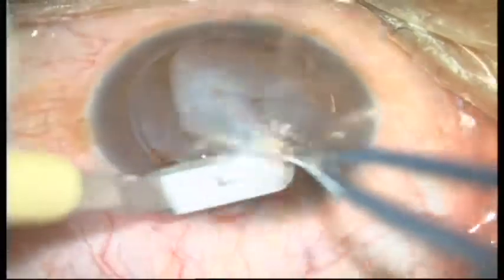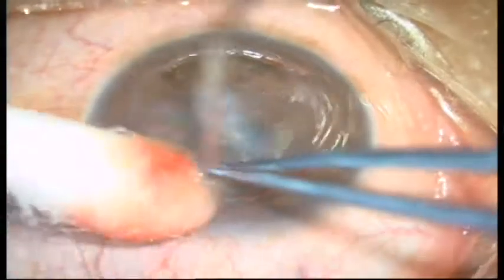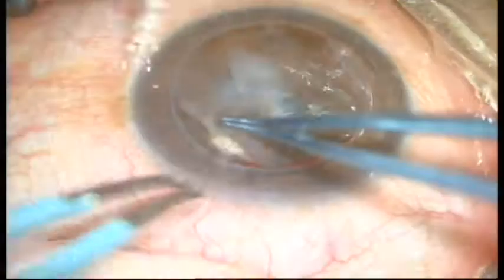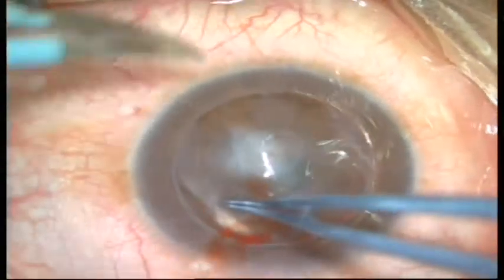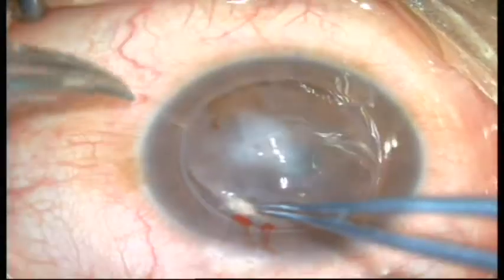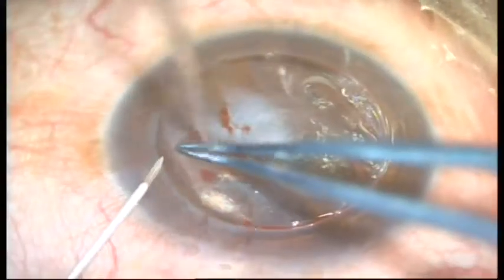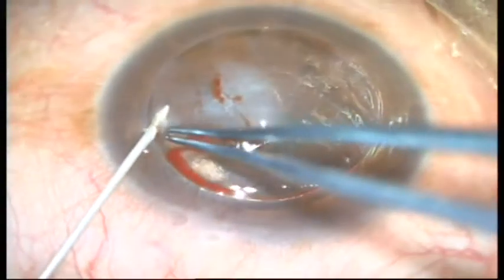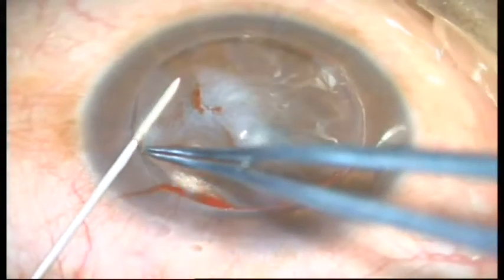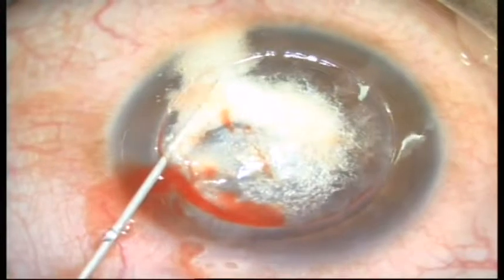After doing 6 quadrants of the Barron trephine to cut 400 microns thickness of the cornea, deepening the edges, the vascularization showed some bleeding, so cauterization at the periphery to decrease the bleeding. Having deep enough stroma, through the insulin needle we injected in the deep stroma to create a big bubble to separate between the stroma and the Descemet membrane.